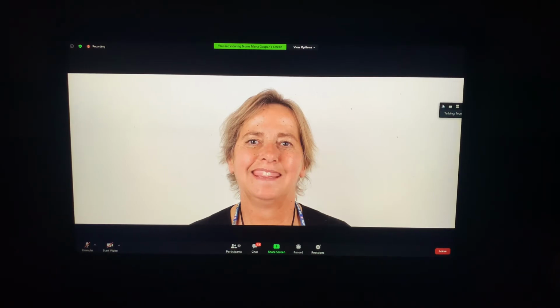Now I will try to place two teeth to try to define where I want my midfacial line and my incisal edge. I placed two teeth in the middle to determine the facial midline, so I can see the symmetry for the two central incisors.